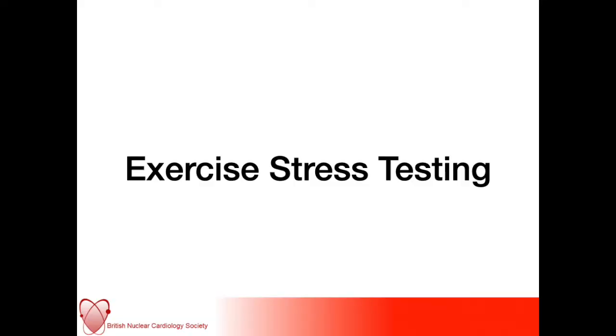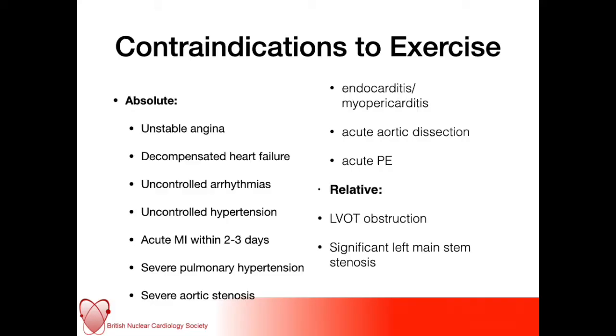How do we do that in the clinic? The first way is the most natural way, I suppose, and that's exercise stress testing. Putting a patient on a treadmill or on a bicycle ergometer and seeing how far they can go.